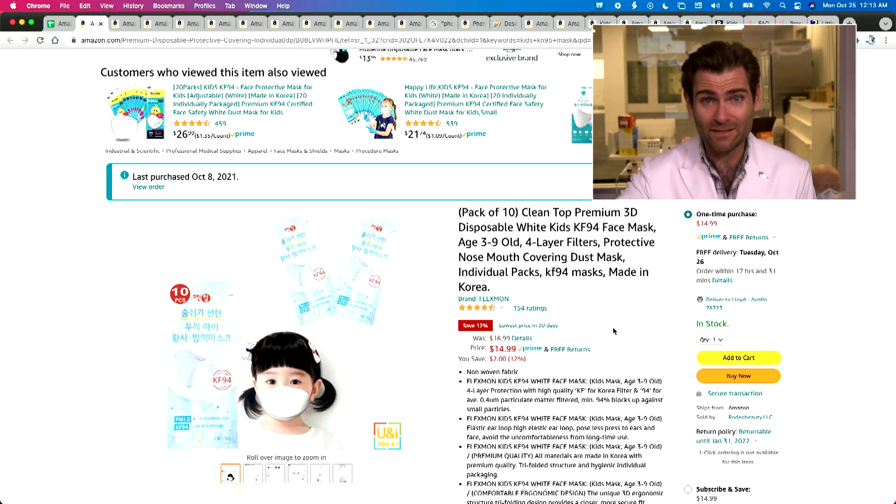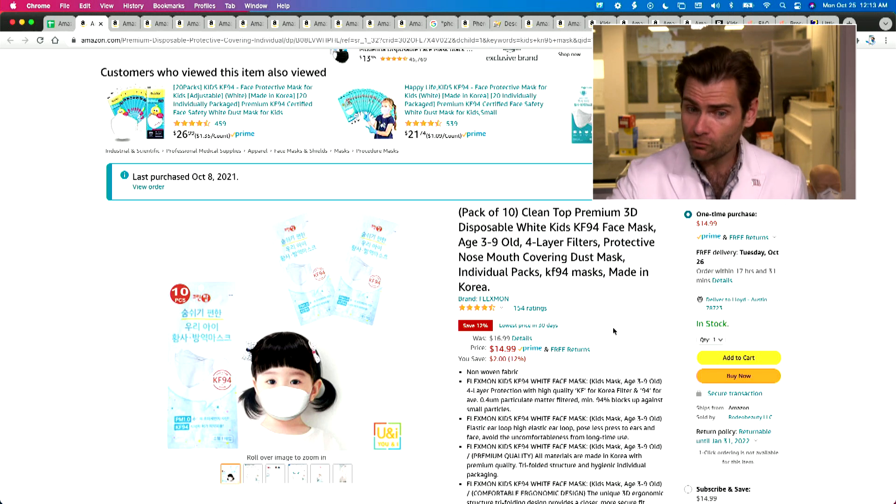Hey everyone, welcome back to the place where we're testing every single mask that we can find on Amazon. Today we are looking at the Flexmon disposable white KF94 for kids.